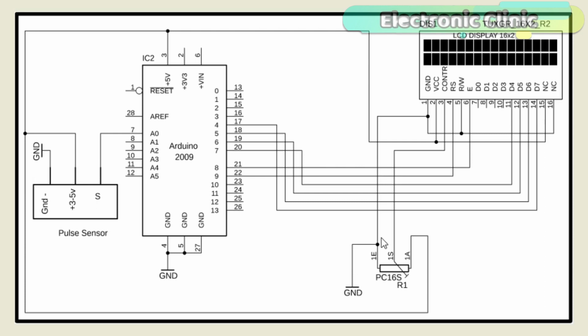As you can see, ground is connected with pin number 1, 5 and pin number 16. 5 volt from Arduino is connected with pin number 2 and pin number 15. The middle pin of the variable resistor or potentiometer is connected with pin number 3 of the LCD, while the other two pins are connected with the ground and 5 volt. Pins 4 to 7 of the Arduino are connected with pins D7 to D4 of the LCD. Pin number 8 of the Arduino is connected with the enable pin of the LCD. Pin number 9 of the Arduino is connected with the RS pin of the LCD.